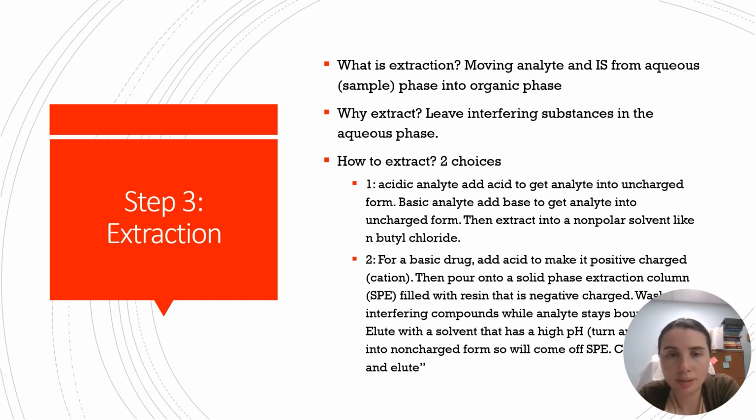One is liquid-liquid extraction. So if you have an acidic analyte, you add acid to make it neutral. If it's basic, you add base to make it neutral, and then you can extract into a nonpolar solvent like N-butyl chloride. The second type of extraction is solid phase extraction.